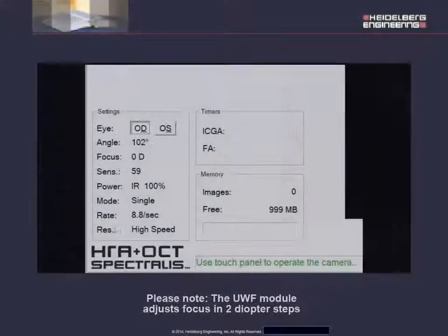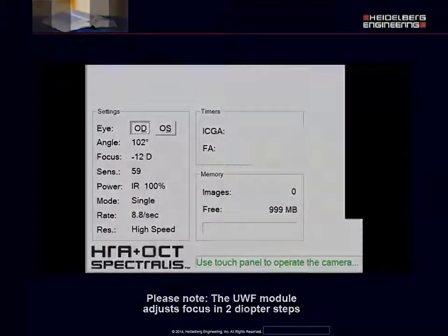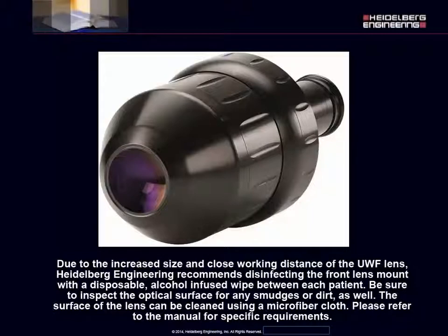Please note, the Ultra Wide-Field module adjusts focus in two diopter steps. Due to the increased size and close working distance of the Ultra Wide-Field lens, Heidelberg Engineering recommends disinfecting the front lens mount with a disposable, alcohol-infused wipe between each patient. Be sure to inspect the optical surface for any smudges or dirt as well. The surface of the lens can be cleaned using a microfiber cloth.